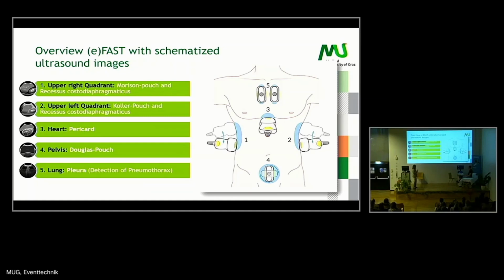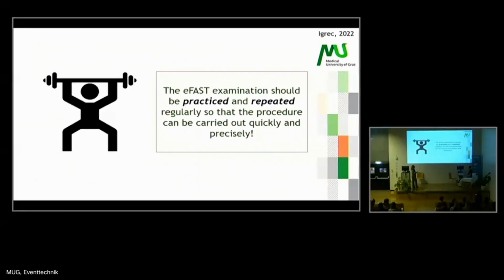Then when you look at it logically, we are going to try to exclude the most often pathological condition, what is really endangering this patient. So it's a pericardial tamponade. So I will do this position, the second one, then this, the third one, suprapubic, our fourth one, and then at the end, pleura.